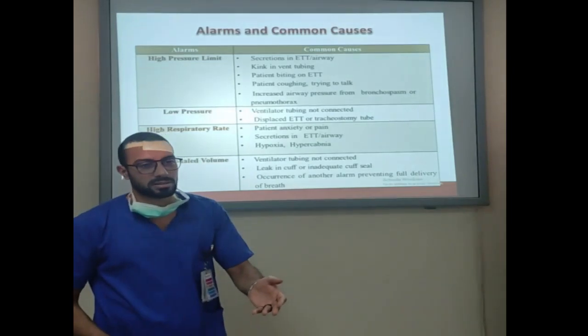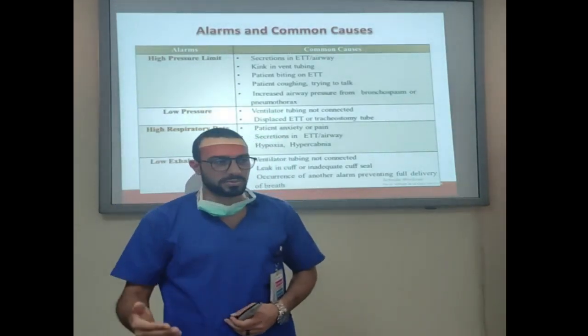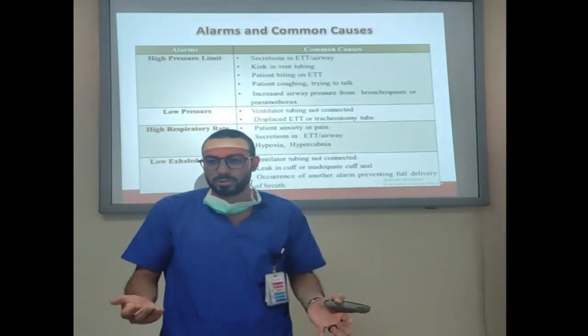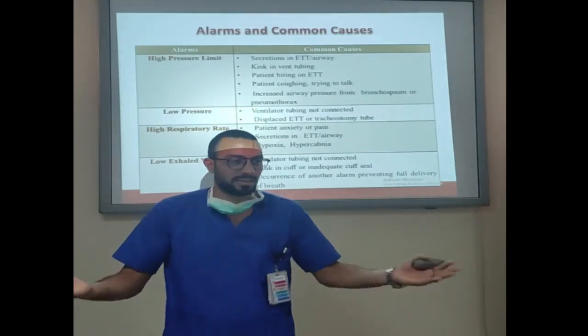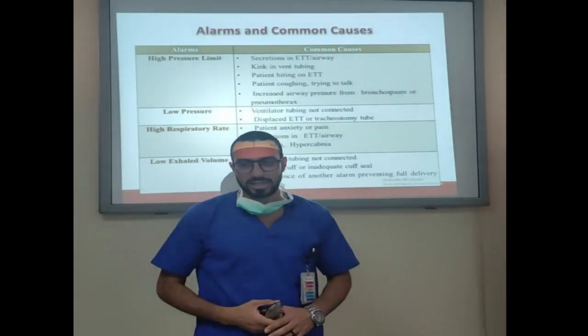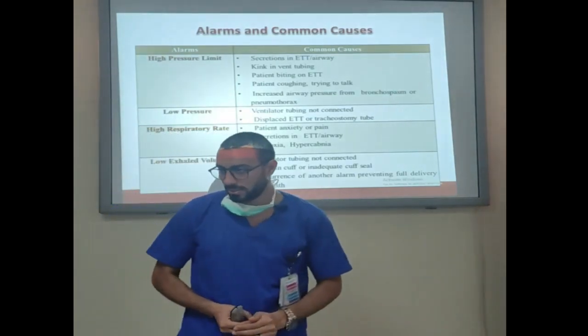And the ventilator, as it's a life-saving device, because you are talking about airway and breathing. So we have a rule that says, treat first what kills first, and airway is the first killer for any one of us. So you should take care. This is airway and breathing. So alarms, you should know alarms very well.